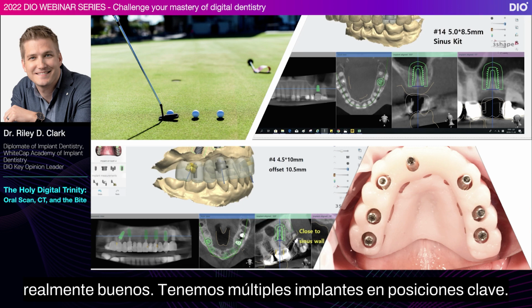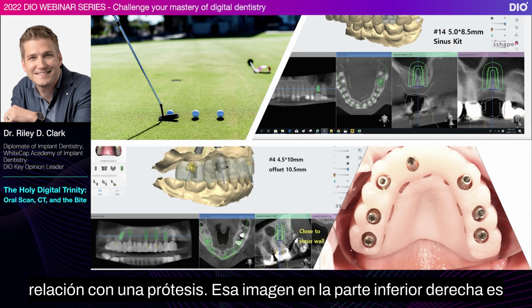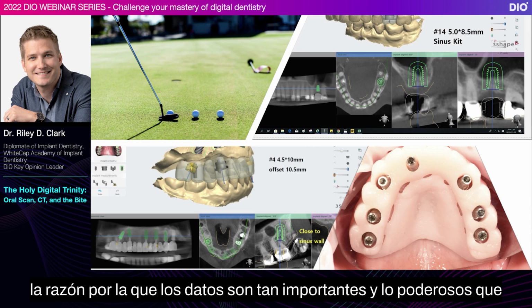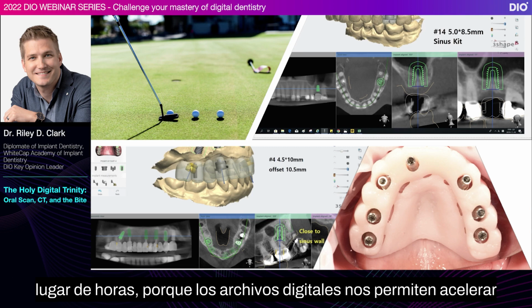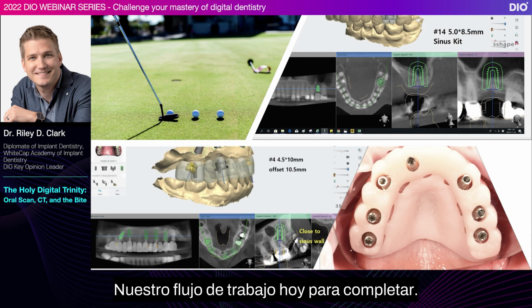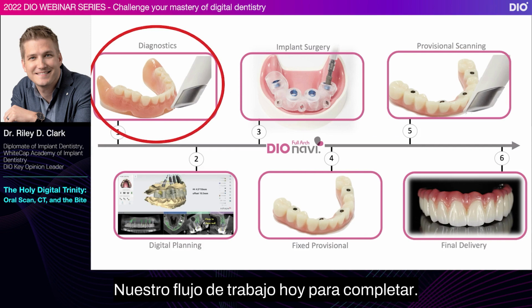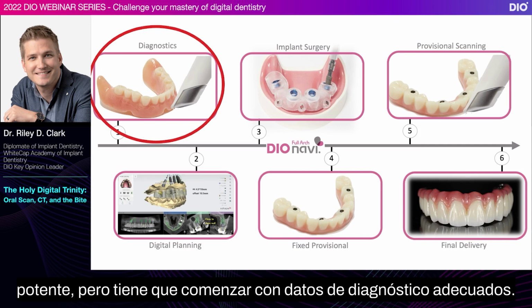We have multiple implants in key positions. They are all parallel to each other, and they fit beautifully relative to a prosthetic. That picture on the bottom right is why the data is so important and how powerful it is, because we can accomplish things like this in a matter of minutes instead of hours, because the digital files allow us to expedite this entire process. So again, I'm going to start where I end. Our workflow today for full arch is really, really compelling. It is efficient, it is powerful, but it has to start with proper diagnostic data.